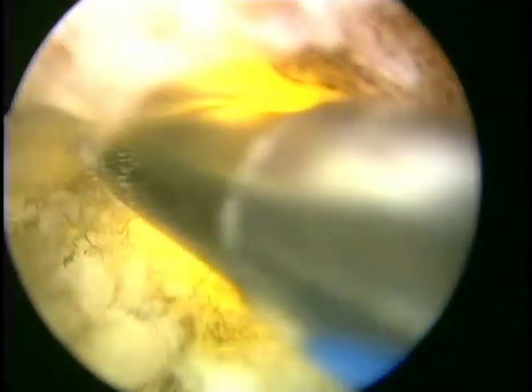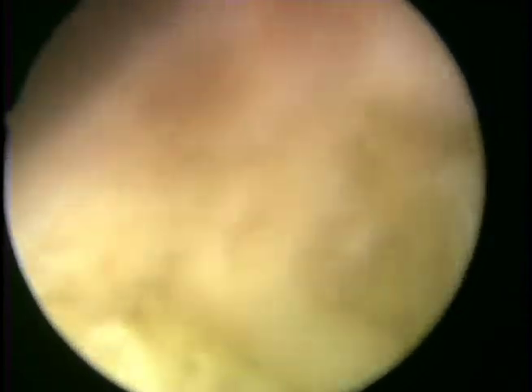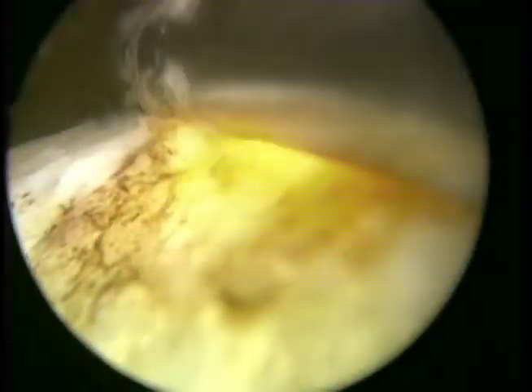re-epithelialization of this area. We now turn more toward the 3 o'clock area, a little higher than standard, simply due to the asymmetry of that left lateral lobe, creating a groove deep toward the surgical capsule, and performing repetitious sweeps as well as drawing motions to create a nice open and avascular working space in which to see the capsule. Sometimes submucosal bleeders can be identified, and the use of coagulation along with compression of that vessel using the fiber to coapt it and ensure no bleeding is all that is required to achieve good hemostasis.